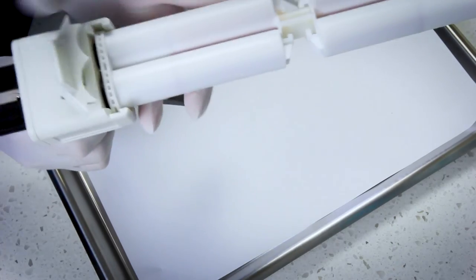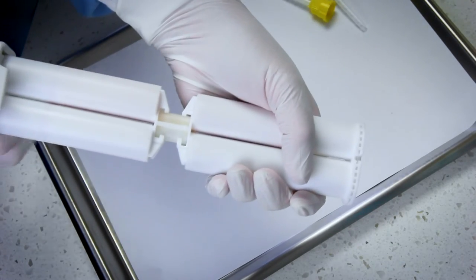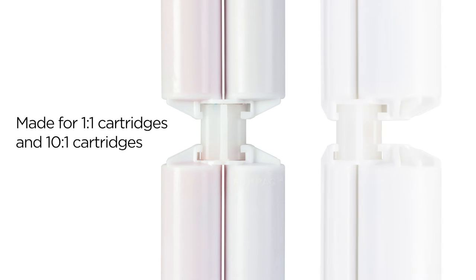Don't throw away half-empty cartridges, and forget about replacing cartridges in the middle of a procedure. Simply connect Refill Ease and combine partial cartridges into one. Refill Ease is made for one-to-one style impression material cartridges and 10-to-one style temporary material cartridges.